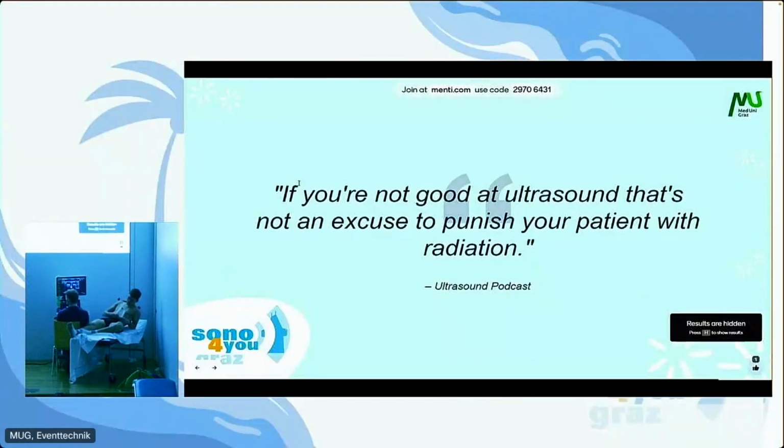And that is it. I want to end with a citation from the Ultrasound podcast. I really like this because I would like to motivate you to just get out there and use ultrasound. Even if you're not quite sure what you're doing, you're getting better by doing it, and you're not harming your patient. In so many wards, there is some ultrasound machine in the back of the last room. Just grab it when you're doing practice or clinical rotations, and use it.